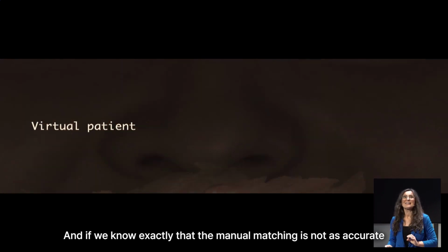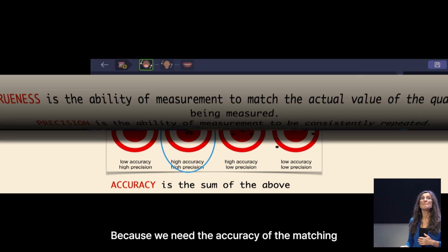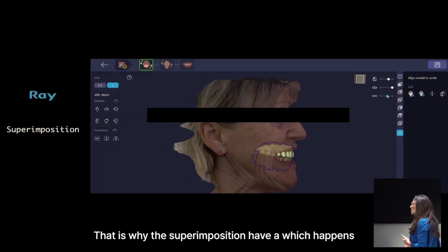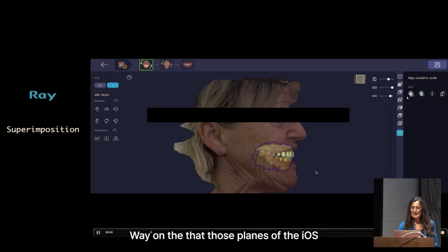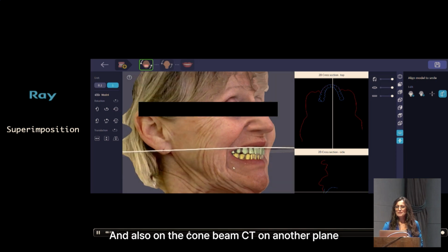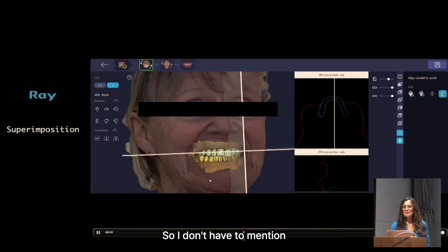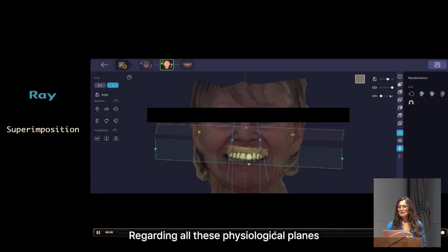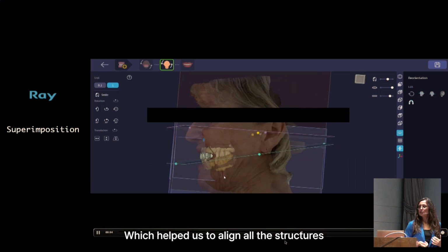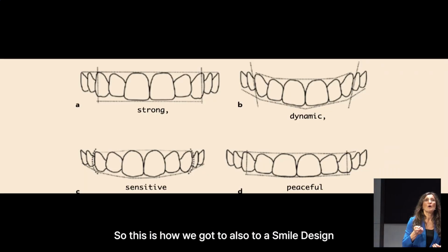And we know exactly that manual matching is not as accurate, because we need the accuracy of the matching. That is why the superimposition happens based on those planes of the IOS and also on the cone beam CT on another plane. You saw it in the lectures before, so I don't have to mention all these physiological planes which help us align these structures. So this is how we also got to a smile design.